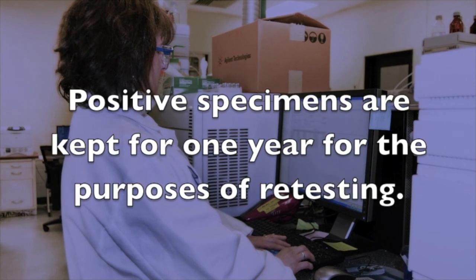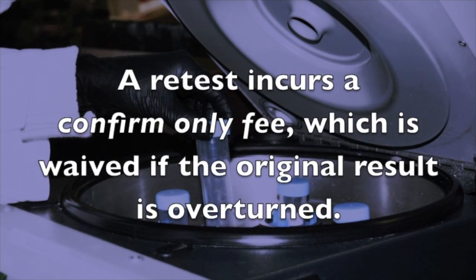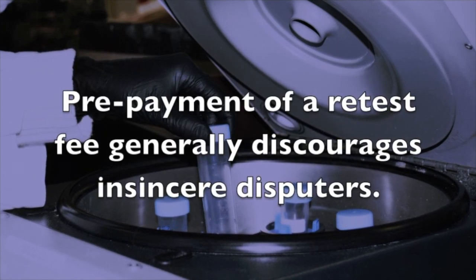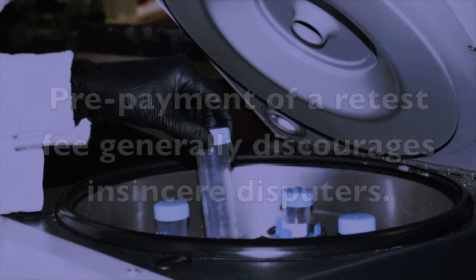USDTL keeps all positive specimens for 1 year for the purposes of retesting. A retest incurs a confirm-only fee prepaid by the donor, and that is waived if the original result is overturned. Prepayment of a retest fee generally discourages insincere disputers.